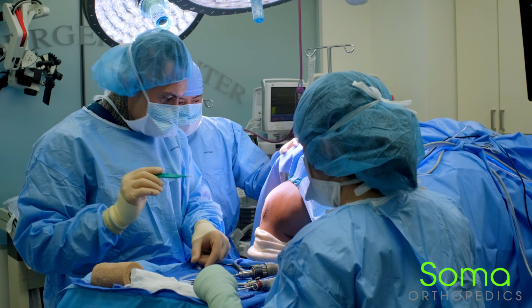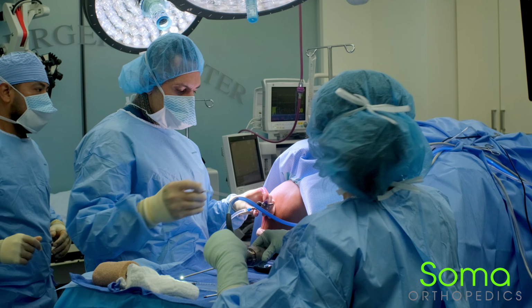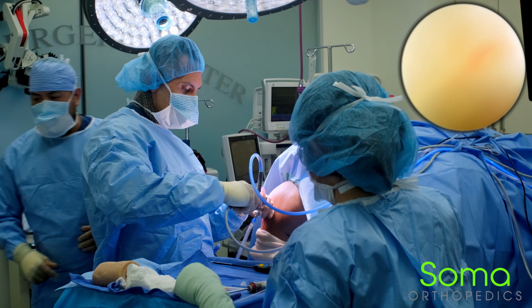I had a patient today who required a procedure where the meniscus was torn. The meniscus is essentially the shock absorber of the knee, and the way we perform this surgery nowadays is through a minimally invasive approach.